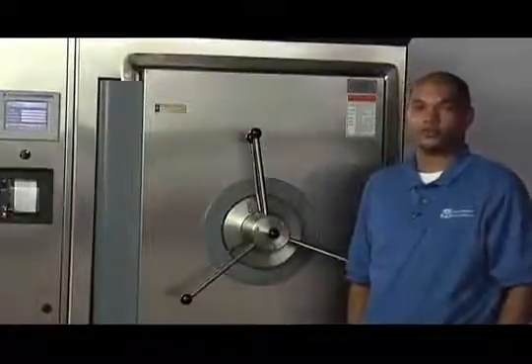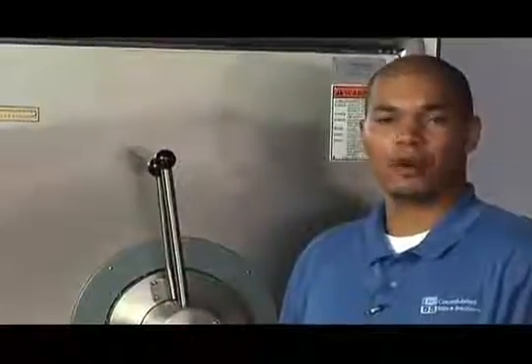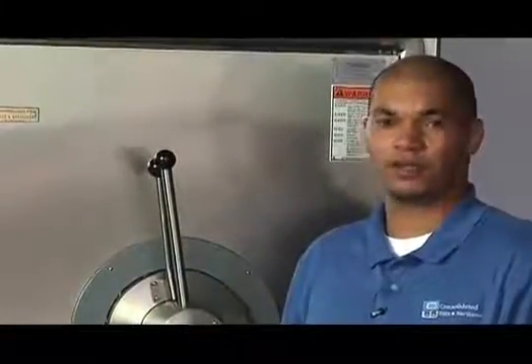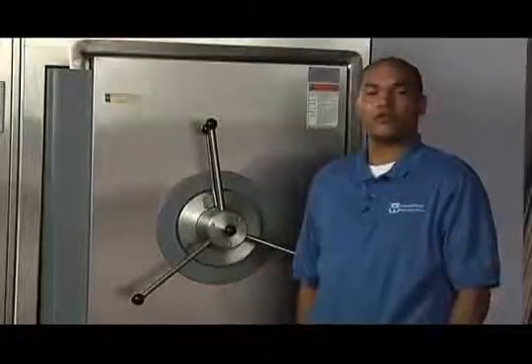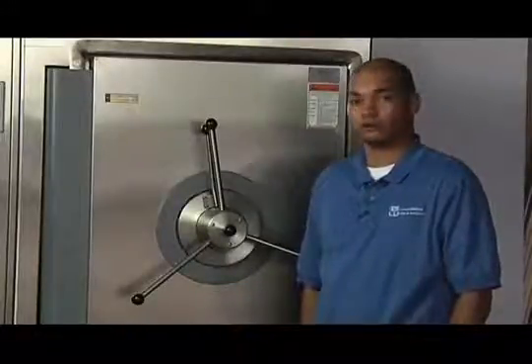Correctly tightening your door is essential to achieving proper sterilization of your goods. If you fail to properly tighten your door you may experience a loss of pressure and steam may escape from the vessel. Properly tightening the door is a simple procedure and if followed will ensure that your goods are sterilized correctly.